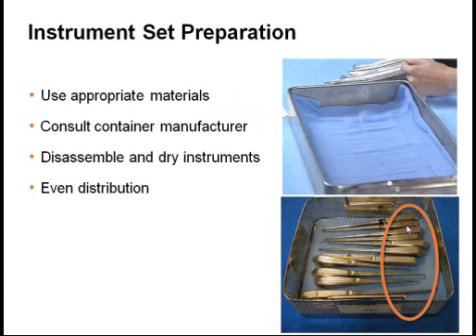Ensure that the instruments are prepared properly for final sterilization. Water can be trapped when the instruments are not evenly distributed and completely disassembled. Do not pile instruments on top of each other, and separate the lighter instruments from the heavier ones.